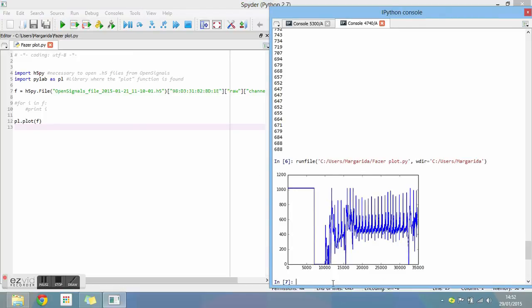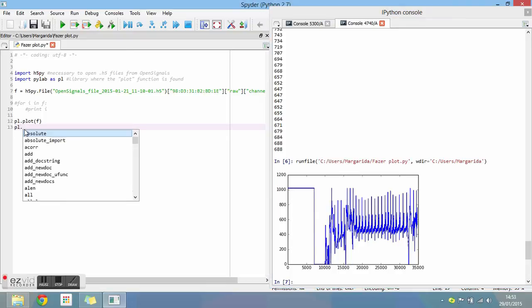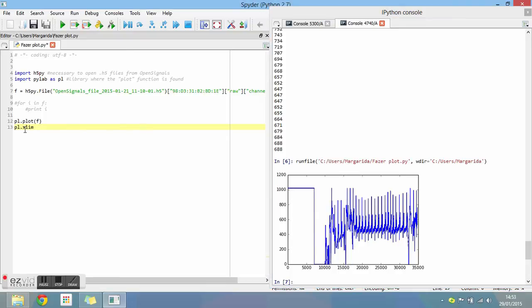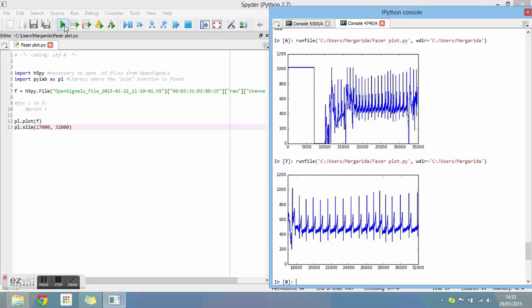One of the many things you can do now is select only a little part of the graphic. To do so, type what you see on the video, including the range of values you wish to select from the graphic. Run the program and it appears on the console.